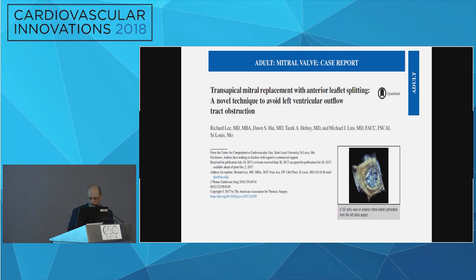One more question. Yes, ma'am. Just think of the concept, right? With LAMPOON, you're completely lacerating the leaflet. Correct. But in this case, you're ballooning, you're in the middle, and now you're tenting up this valve. So you might actually pull up the subvalvular apparatus, like the papillary muscles. Would that change the configuration below? Because we did this on cardiopulmonary bypass, we did not see any tenting of the subvalvular apparatus.